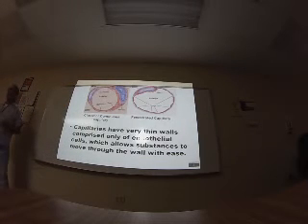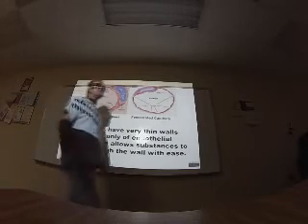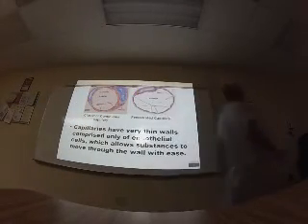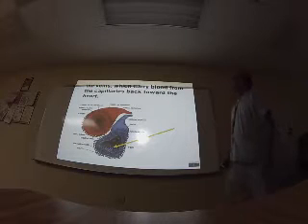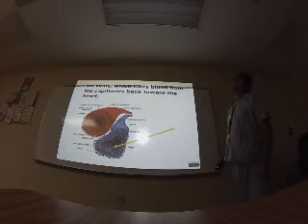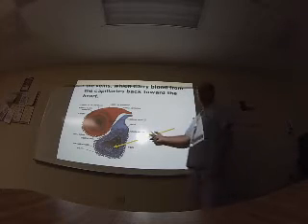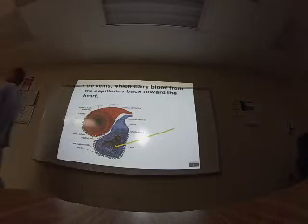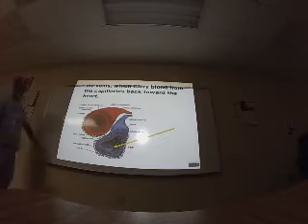We are going to scan something big. Remember, ultrasound is not microscopic. Ultrasound is for things that you can see. The veins carry blood from the capillaries back toward the heart. In other words, the direction of the blood in the veins is to the heart. The direction of the blood in the arteries is away from the heart.